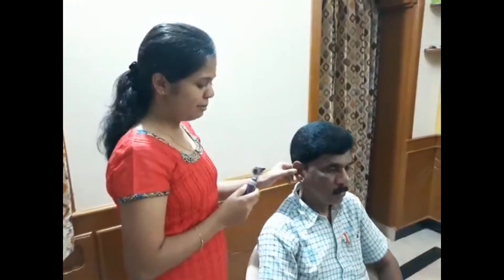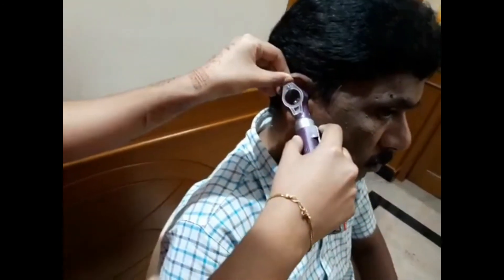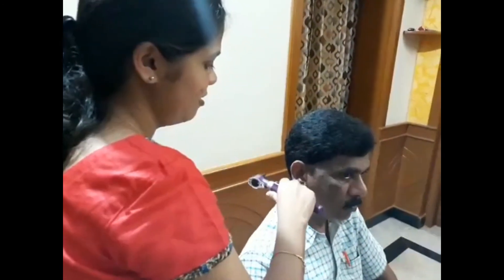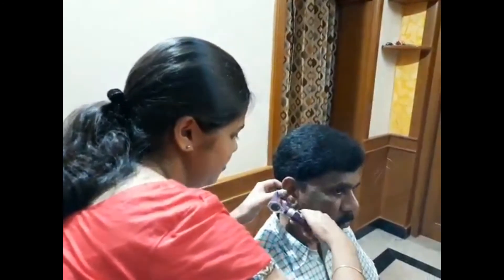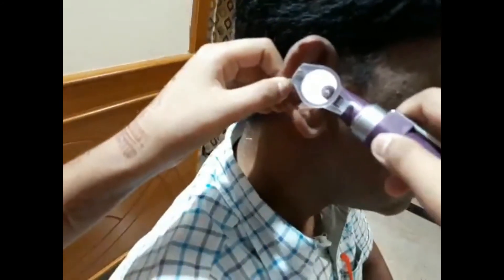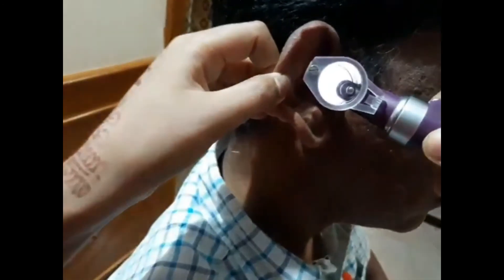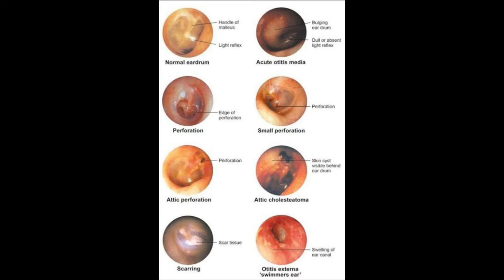Now checking the internal ear of the patient using the otoscope. For inspecting the middle ear, straighten the ear canal to insert the otoscope. I am holding this with my right hand for the right ear and placing my little finger on the cheek of the patient for support. Now I am turning on the light and pushing this inside his ear. I did not notice any abnormalities and you are fine.